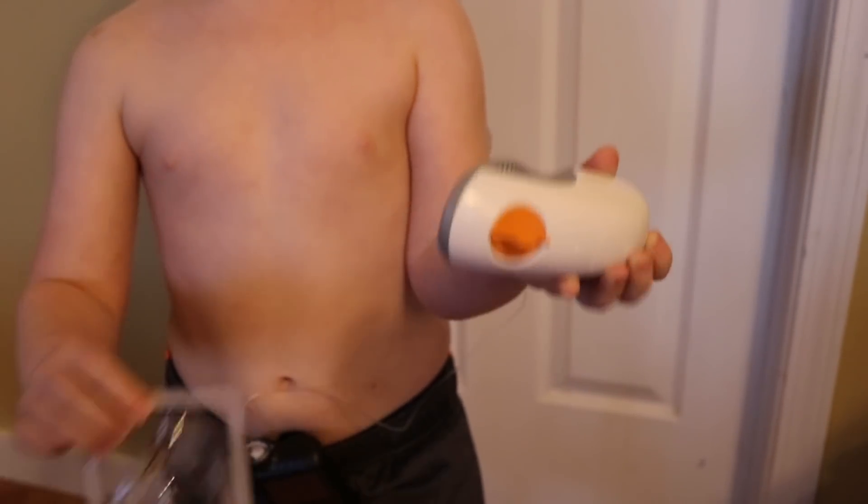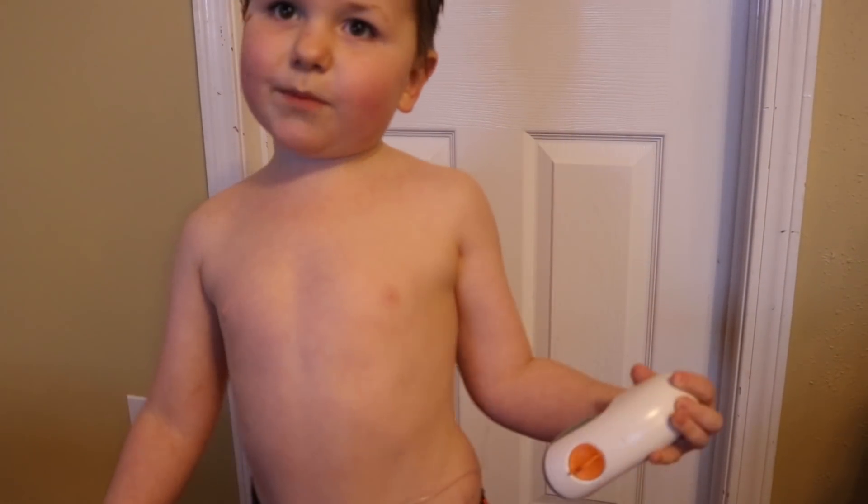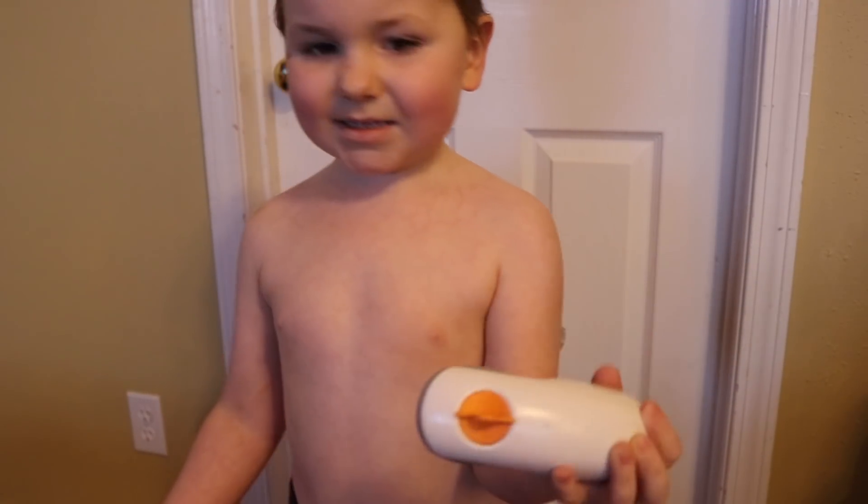What's the button do? That's what stabs it into your body. Okay, are you ready to do it? Yes.